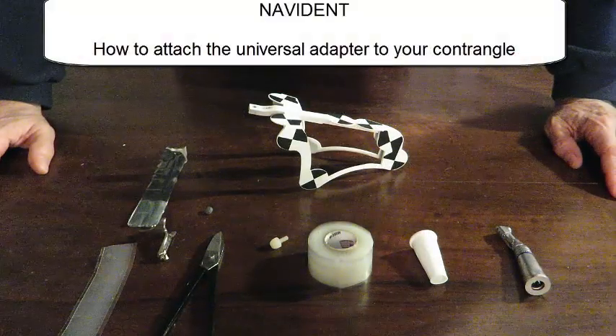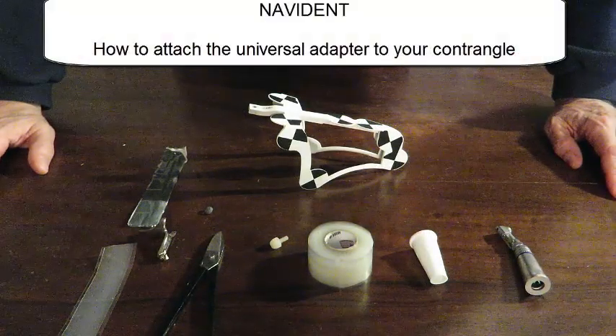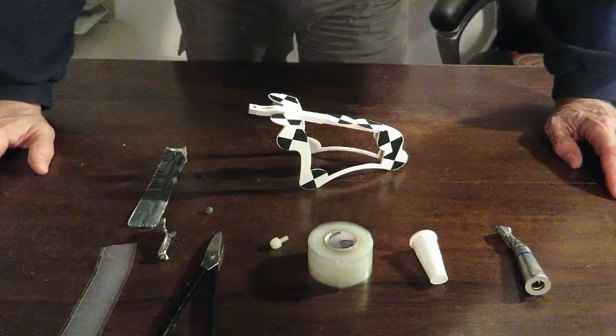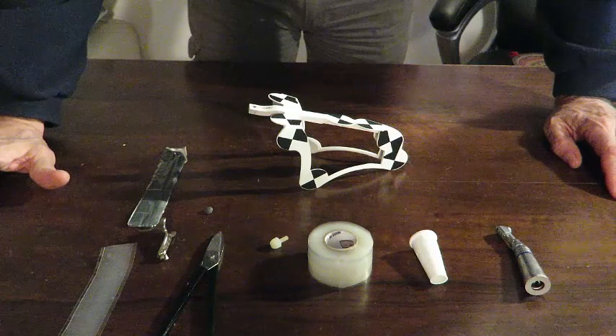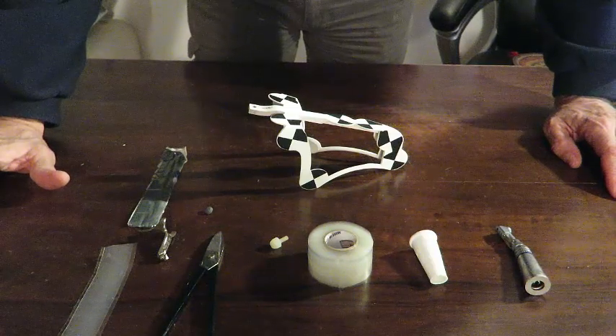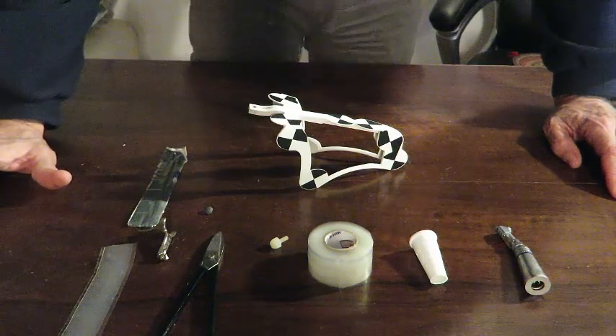Today we will present the procedure in order to adapt the universal adapter to a contraangle. The procedure is pretty straightforward.